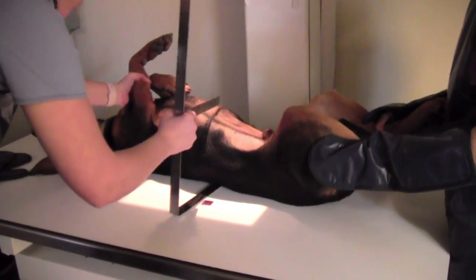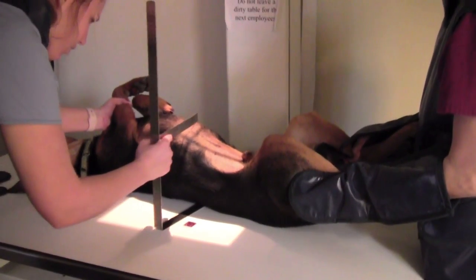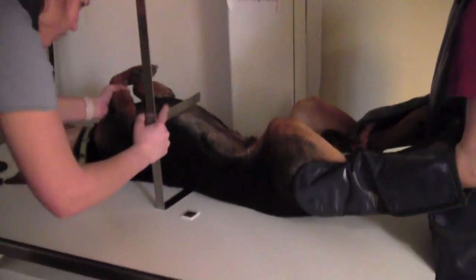A trough may be needed, but the patient should be placed in dorsal recumbency with its head gently pulled forward. The forelimbs should also be extended forward with a sandbag if possible, and the hind limbs should be kept in a natural position, also with a sandbag over each limb.